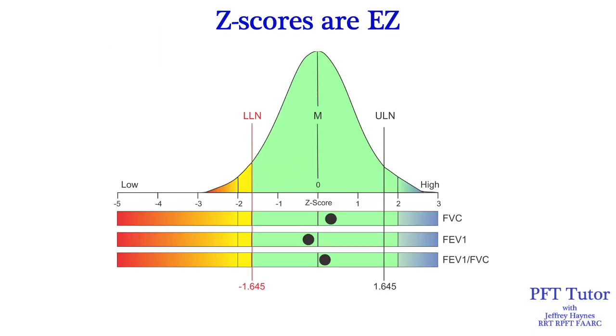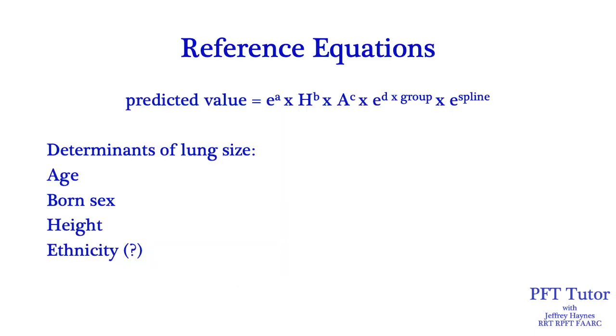Well, that's all well and good, but there may be some of you out there thinking, what the heck is a Z-score? And some of you may have statistics phobia. Well, firstly, let me ease your mind and tell you that Z-scores are really simple, and I'll be able to teach you how to use Z-scores in a matter of minutes. Let's start from the beginning with reference equations.